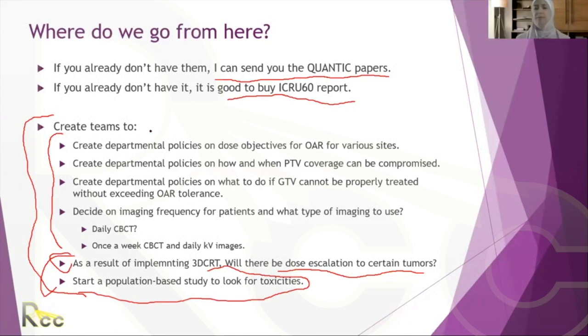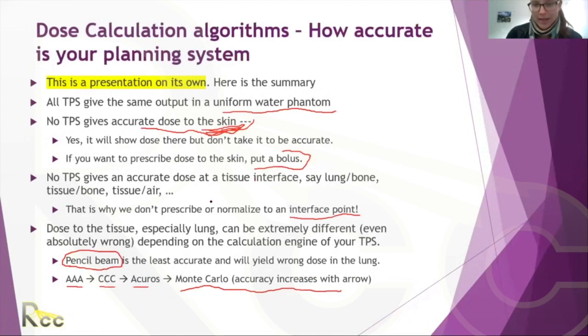Sure. Can you clarify what is meant when we say that skin is a buildup region? And does this have to do with photon backscatter? Okay, so this is a physics concept. If you go back and read the physics of interaction of photons, you know that high energy photons, tamam? I'm going to try to draw something here.